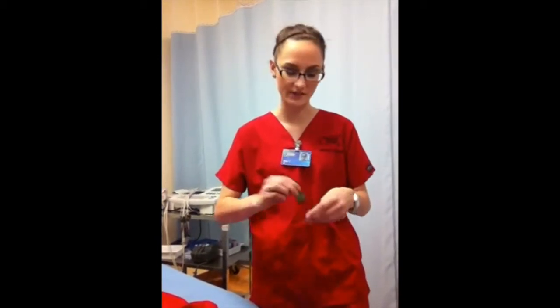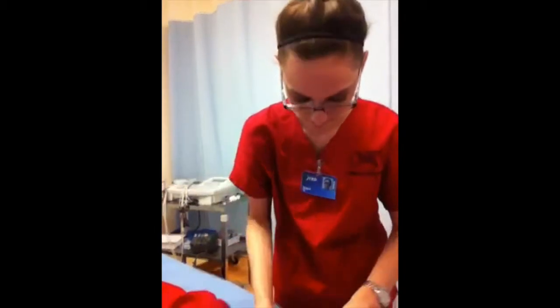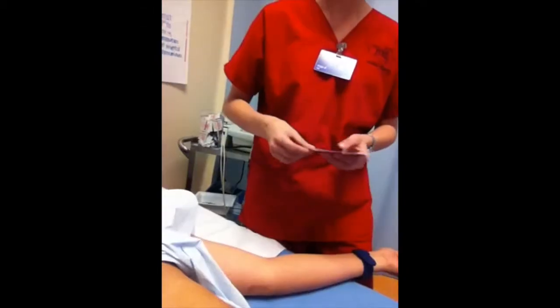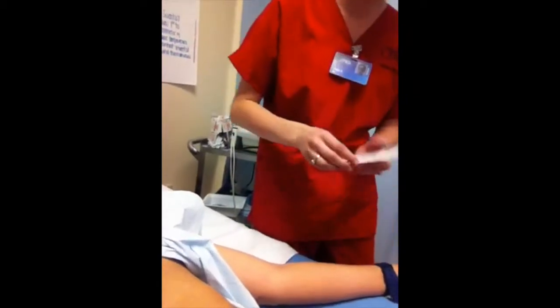Place your first electrodes on each of the inner legs adjacent to the bone to ground electricity, and make sure that the tab is facing towards the patient. Place the next two electrodes on the inner arms of the patient and make sure that the tab is facing down.